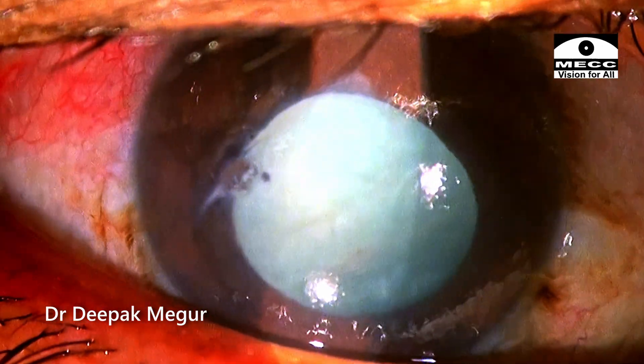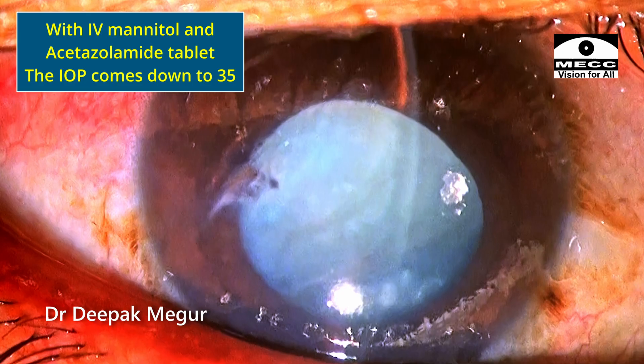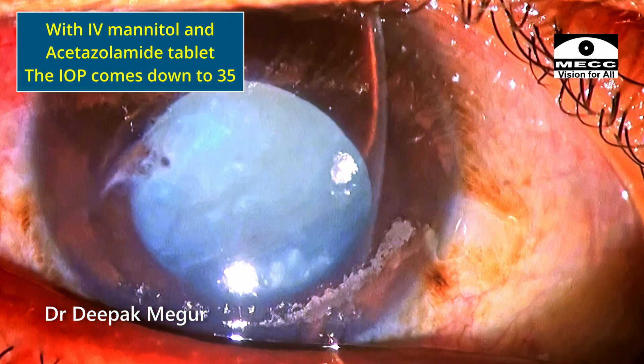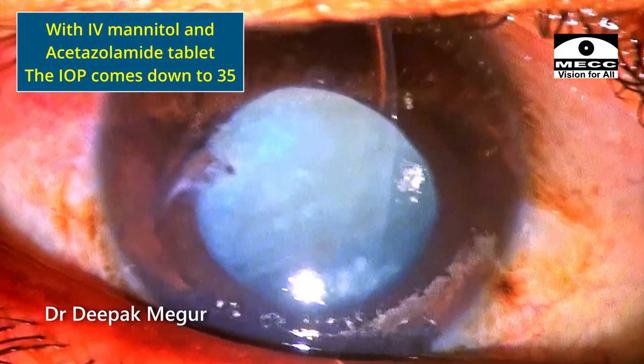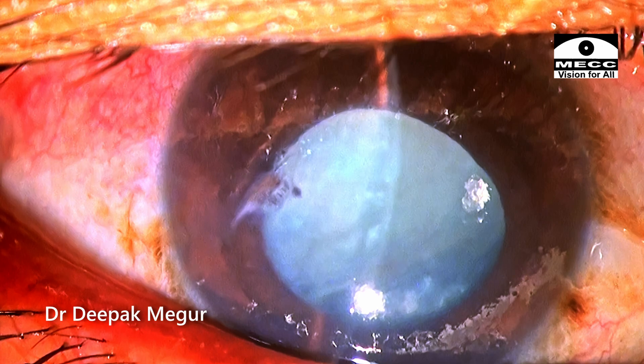Surgery is planned. Intravenous mannitol and acetazolamide tablet are given pre-operatively. The IOP comes down to 35. Time to start the surgery.